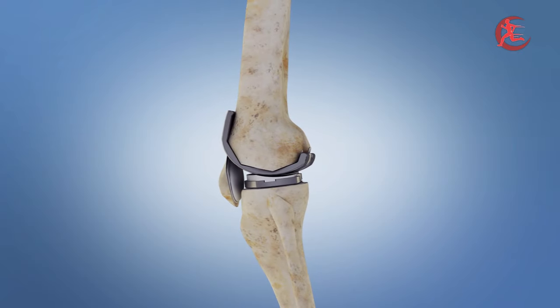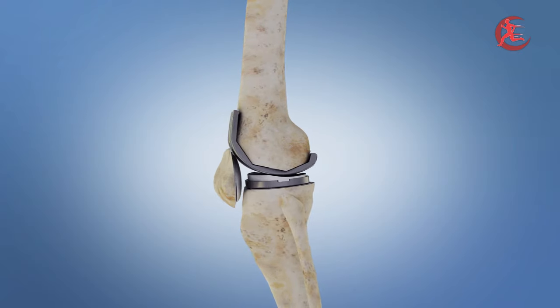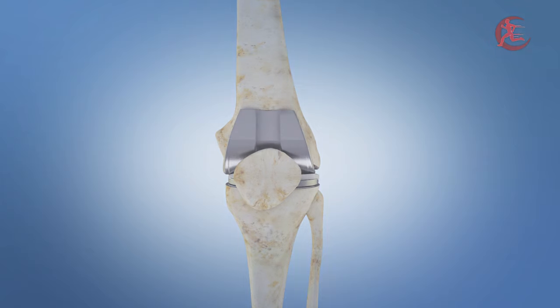And just like that, the remarkable journey of total knee replacement is complete. Get ready to embrace a future filled with mobility, comfort, and endless possibilities.